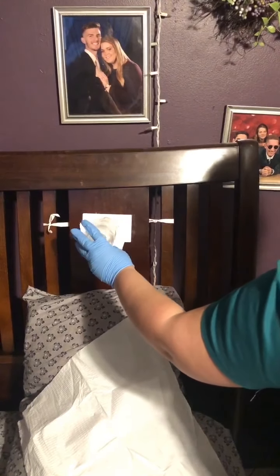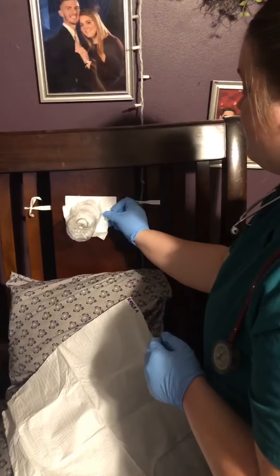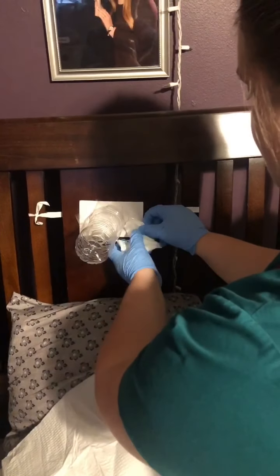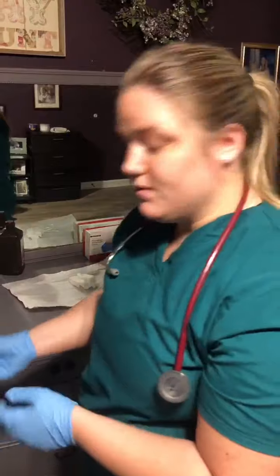And then I can take off the gauze pad. So after I take this off, I am going to note the color, the odor, the clarity, and the amount on here, and then I can throw that away.